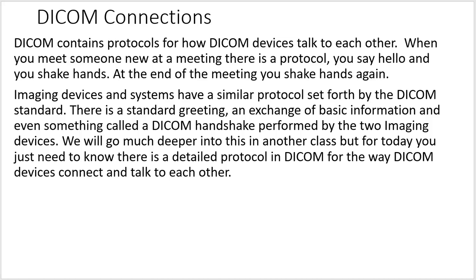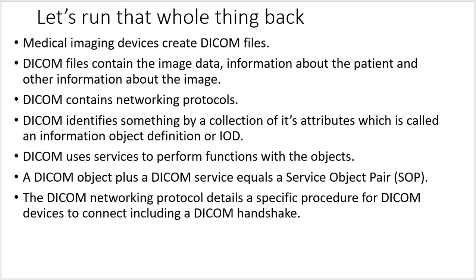Imaging devices and systems have similar protocols set forth by the DICOM standard. There's a standard greeting, an exchange of basic information, and even something called a DICOM handshake performed by the two imaging devices. We will go much deeper into this in another class, but for today, you just need to know that there's a detailed protocol in DICOM for the way two DICOM devices connect and talk to each other.